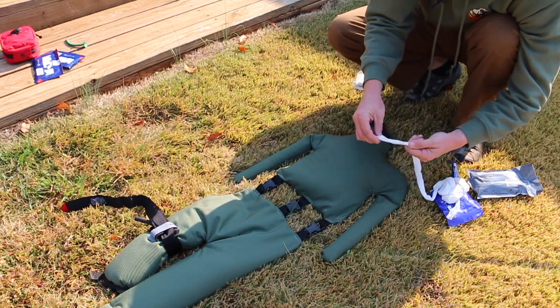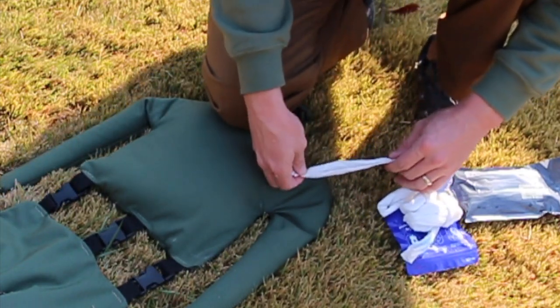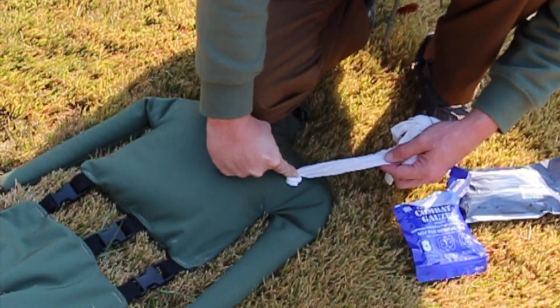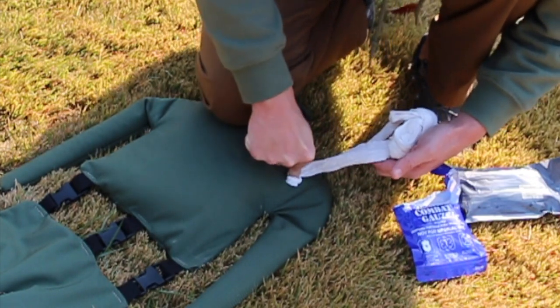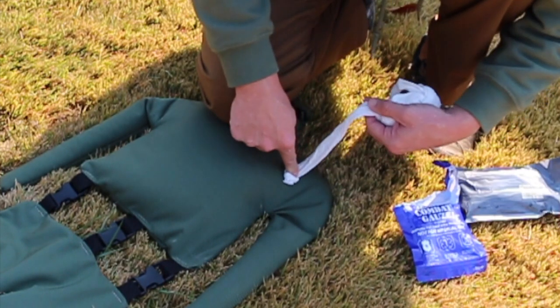Easiest way I've found to do this is just tie a knot in the end of it. So we're trying to put a knee to hold pressure down here, and this finger goes into the wound, and you got to find that artery, you got to find the source of the bleeding. So it doesn't matter where you're at on that, you stick your finger down, you may have to try to find it, but once you find that source of bleeding, and then you would put this to the source.